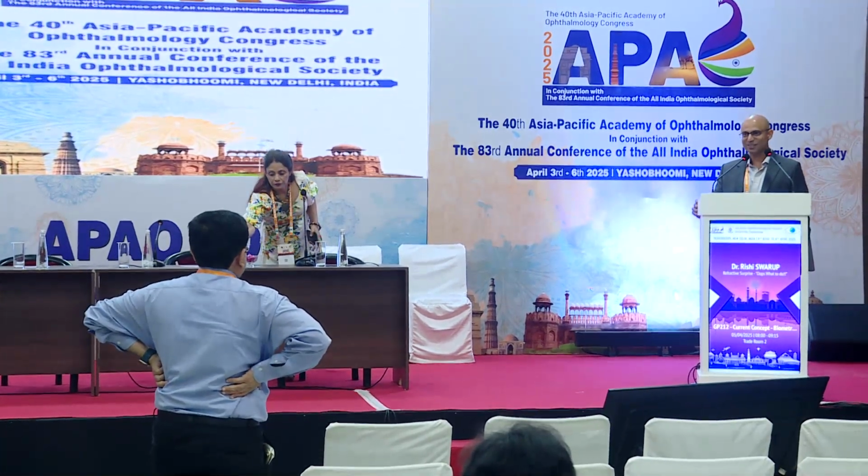I have used, yeah. And what are the results? So I think you have to look at the topography. If it's a very uniform topography and there's no decentration, I think you can go ahead and use, because these patients basically desire spectacle independence. I have used trifocals and bifocals also, but you have to use it selectively and you have to tell them about possible problems they might face.